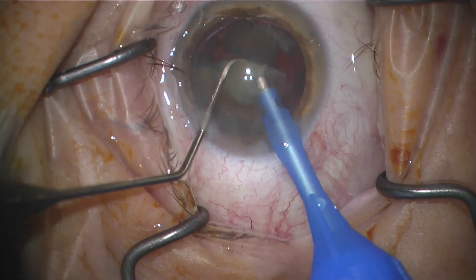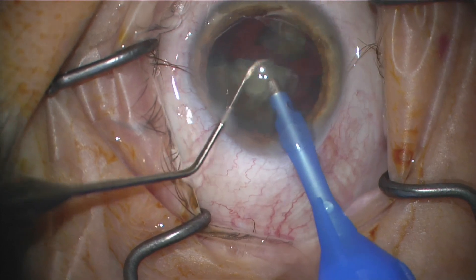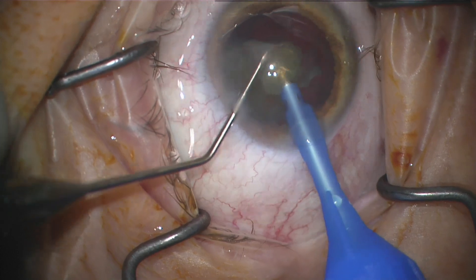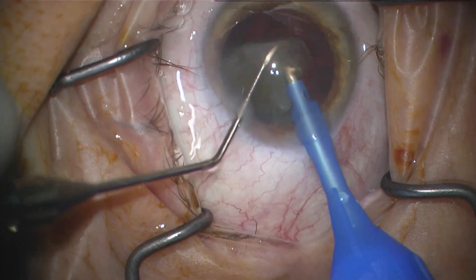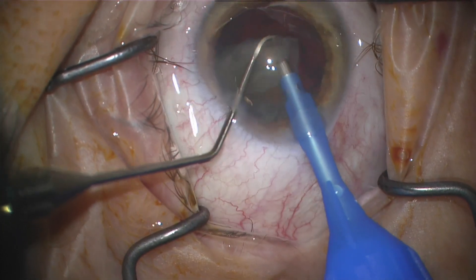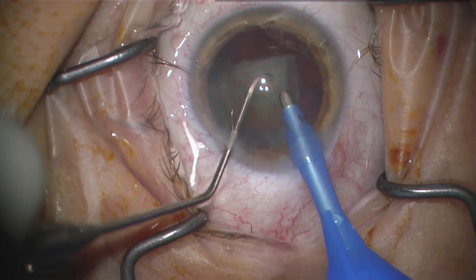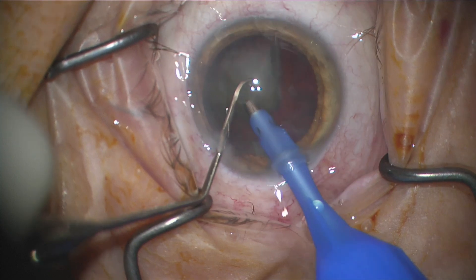You can see the piece is kind of moving around — it works similarly in terms of the phaco dynamics or irrigation dynamics of a Centurion or Stellaris or any other machine. The pieces will come to you, but I do use a lot of my chopping to feed it in there.